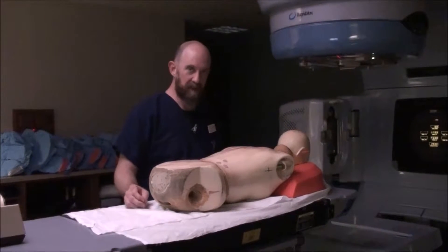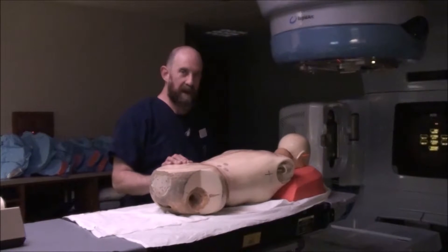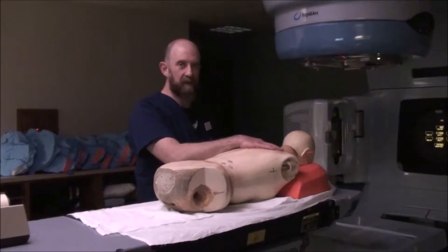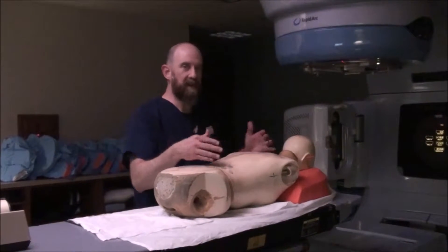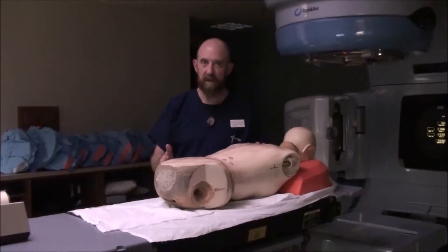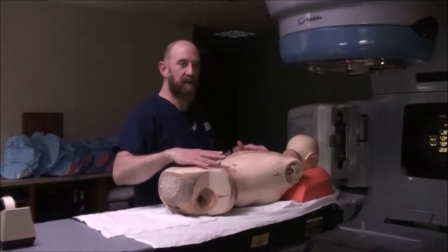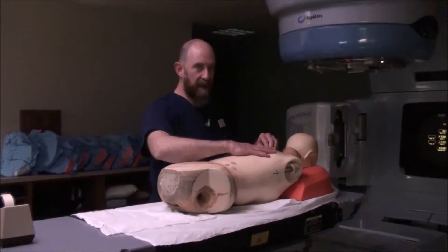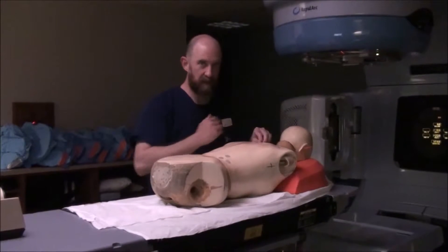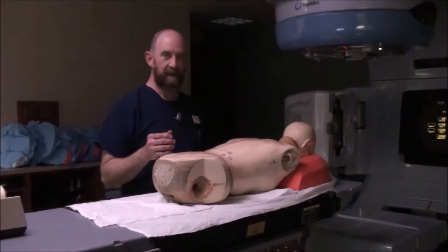This doesn't work on someone who is extremely kyphotic or scoliosed. If they're really kyphotic, you're not going to get them prone anyway. If they're scoliosed, it's going to be difficult to get them straight with the laser, but get them as straight as you can. A straight patient in the simulator is easier to reproduce in a straight fashion in the treatment room, so you always want to get your patient straight for every simulation — that aids in reproducibility.